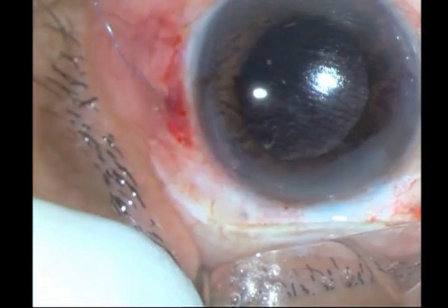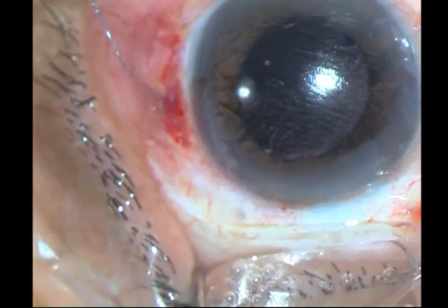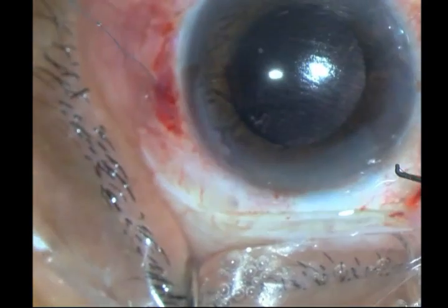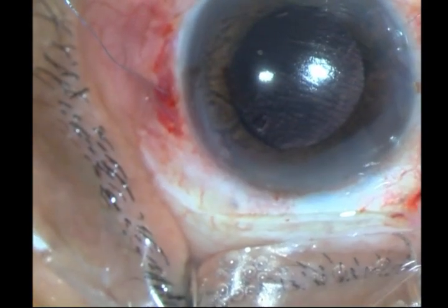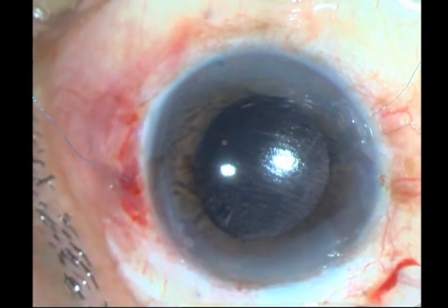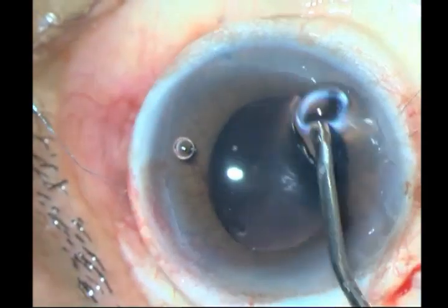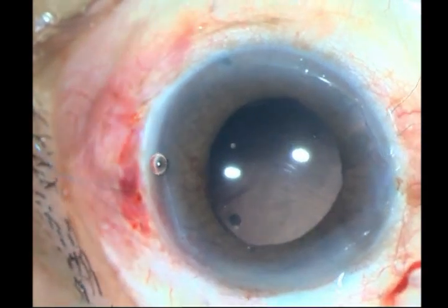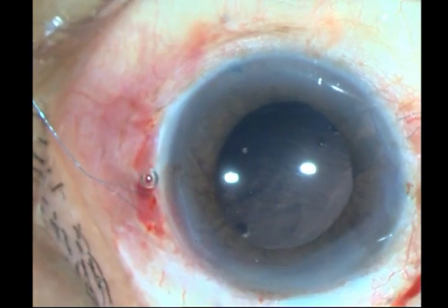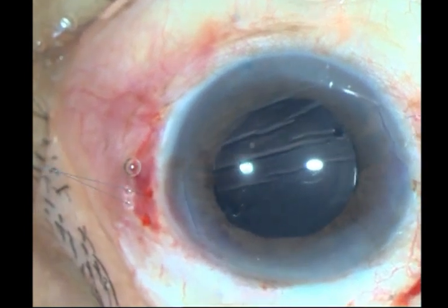Sorry about the cornea — my assistant is not too fast in wetting it. Once I have picked up the slack and got it into place, it is time to pull out the suture ends. Finally I did it myself. Put in some viscoelastic. The lens looks fairly well centered, there is no tilt, and it doesn't seem to be tugging on the iris anywhere — that's a good sign.